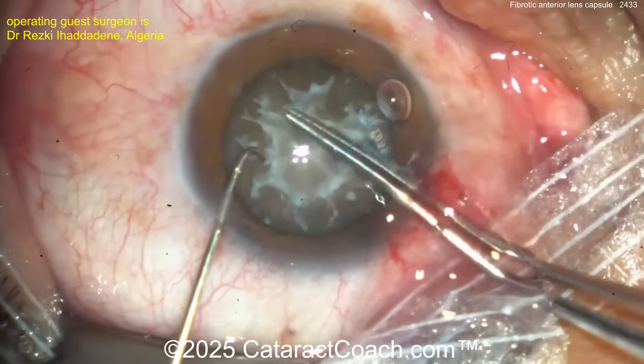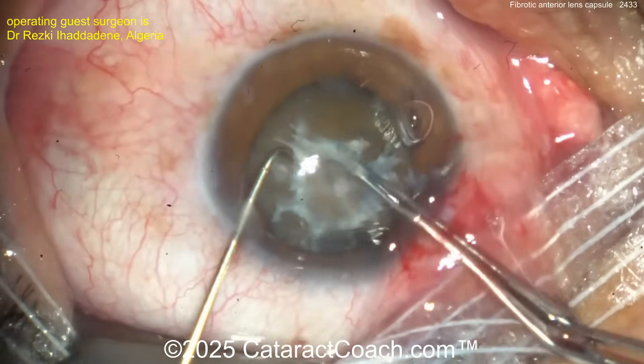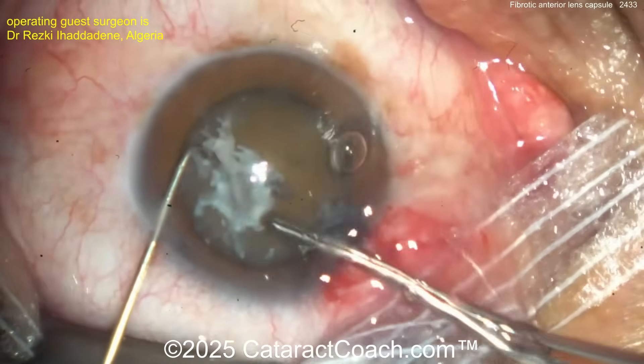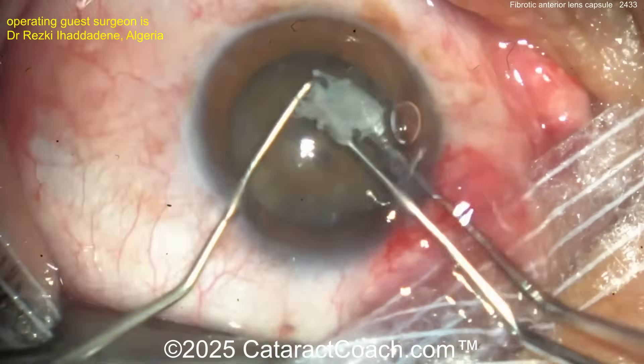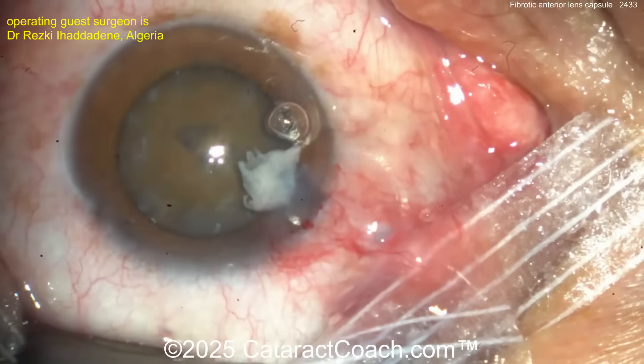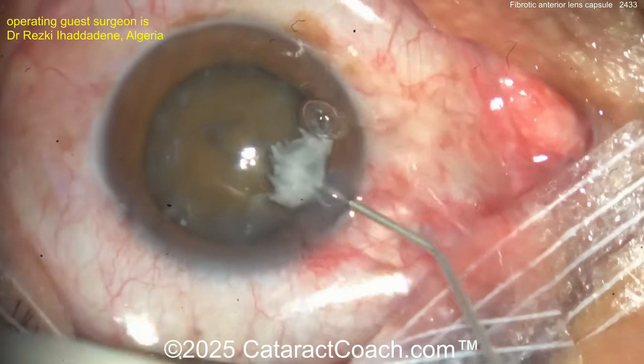You're obviously a great surgeon — beautiful job. If it does get stuck, sometimes you don't have to just cut it. Look at that — there's the whole fibrotic membrane. The capsulorrhexis is done, and now look — the whole membrane can be peeled up! Whoosh — that was pulled right out of the eye!